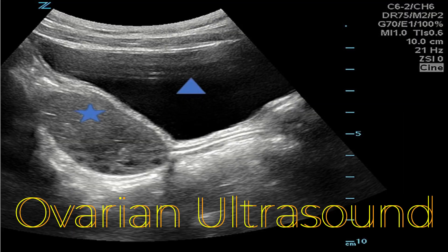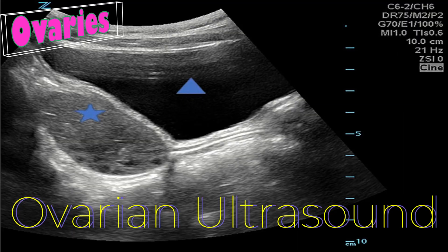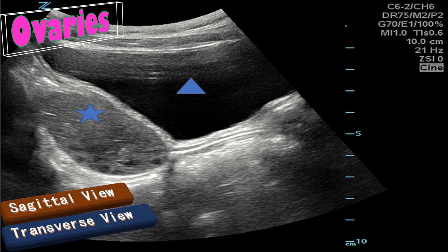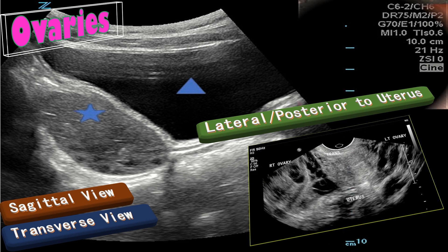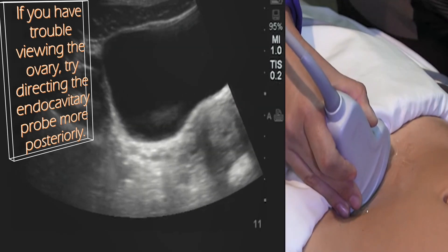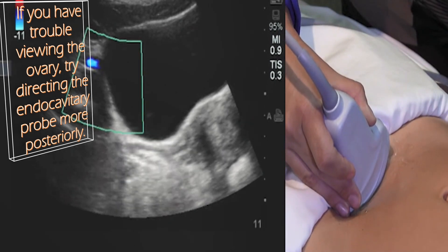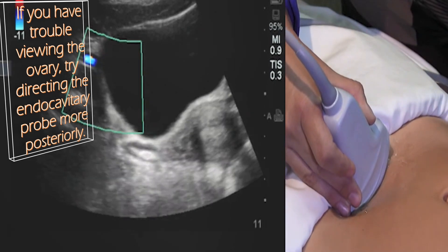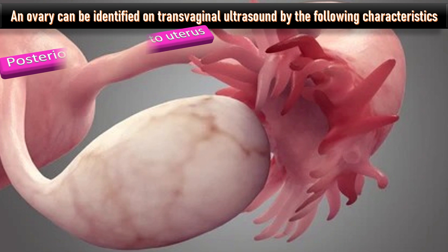How to visualize ovaries on ultrasound: in general you can use either sagittal or transverse view to identify the ovaries, which are usually located lateral and/or posterior to the uterus. If you have trouble viewing the ovary, try directing the endocavitary probe more posteriorly. An ovary can be identified on transvaginal ultrasound by these characteristics.